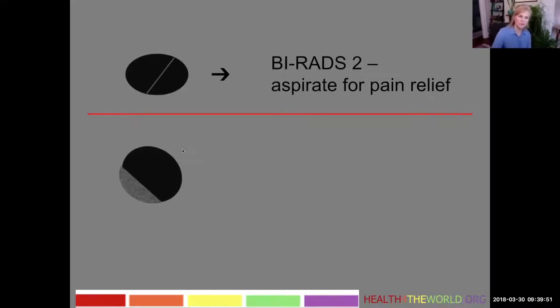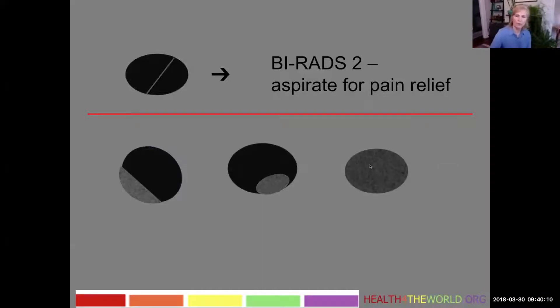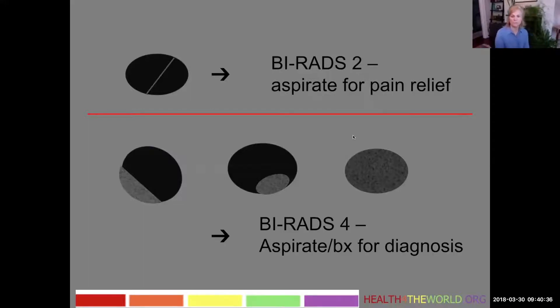They don't need any treatment unless the patient desires aspiration for pain relief. On the other hand, if we see a cystic structure that has some anechoic portions but more solid-looking components that are not dependent, or an intracystic mass — a mural mass growing off the wall — or diffuse low-level echoes internally, these are all more suspicious appearances. It's possible the last case with diffuse low-level echoes is just a complicated cyst, but it's also possible it's a solid lesion. You can't always tell sonographically unless you see these echoes move. We're going to call these BI-RADS 4 and either aspirate or biopsy these lesions for diagnosis.